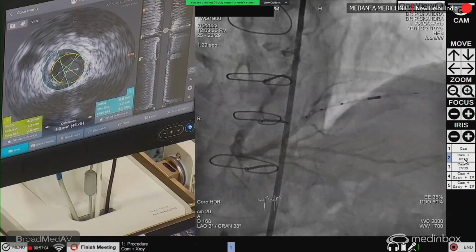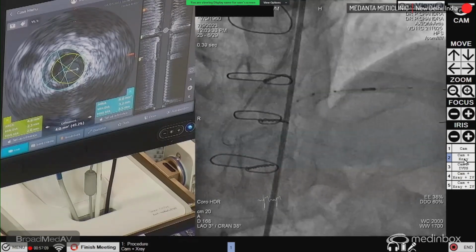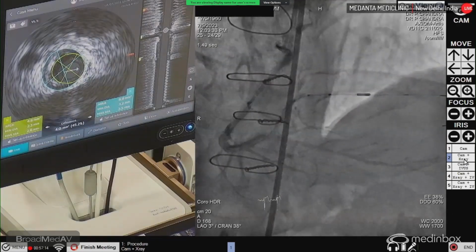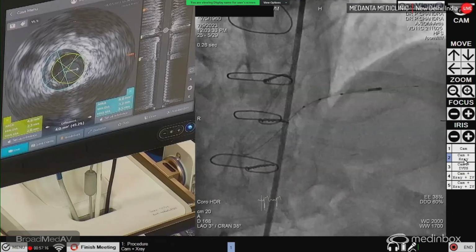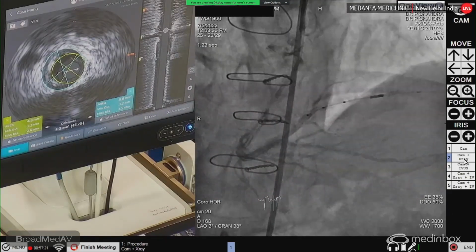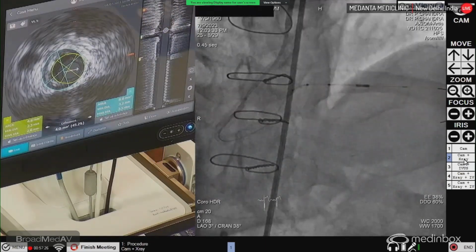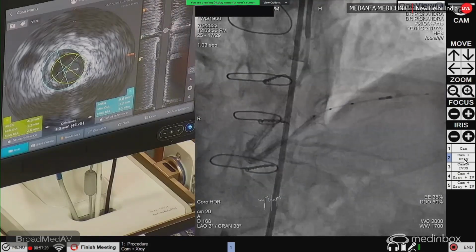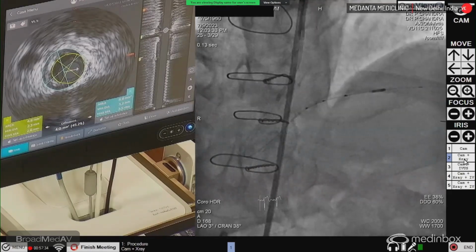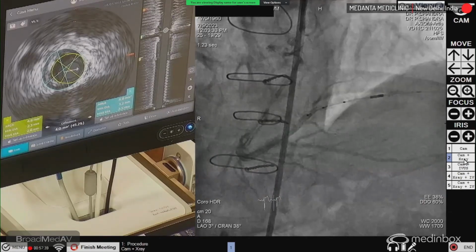Or a 38 Expedition may also be a good idea. Alpine, 2.5, 38. Give me a 2.5, 38. Or a 40 Cruise. The lesion is starting from that point. Yeah, from this point. No, sir. This 10 marker is, I think, normal only. So 32 we can take 2.5, if we are considering. I mean, 32 will be small. No, I want a 2.5 into either a 38 or a 40. Yeah, any one of them will be fine.